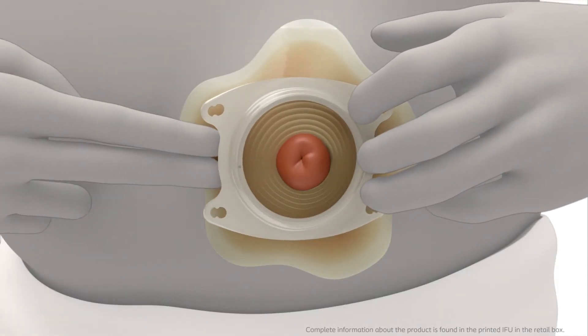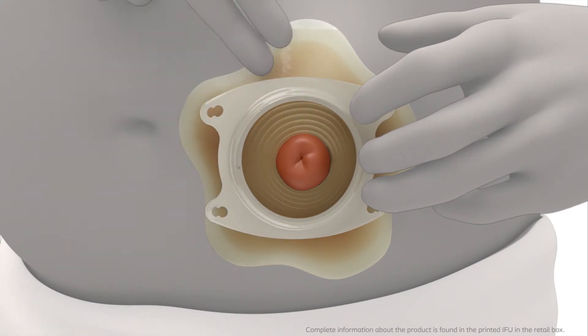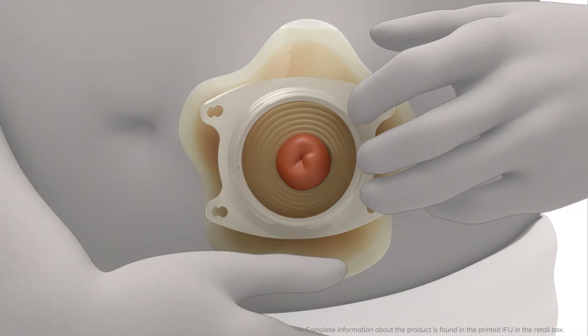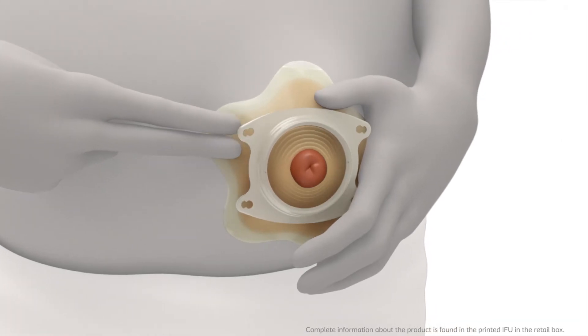Apply pressure from the centre of the adhesive and outwards in multiple directions to ensure secure adhesion between the adhesive and the skin around the stoma. Secure between the petals first and then on the petals.